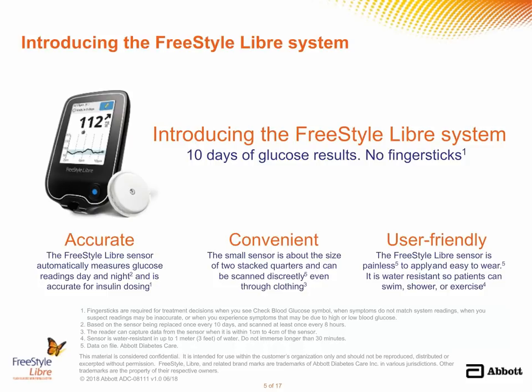Unlike blood glucose monitoring, the FreeStyle Libre system does not require the patient to perform finger sticks. As the FreeStyle Libre system is factory calibrated, glucose readings are not dependent on any fingerstick BGM calibrations.